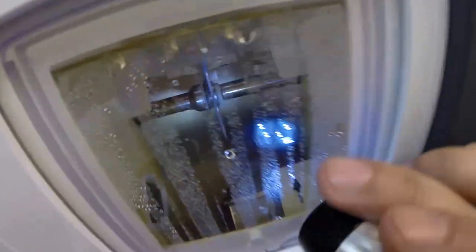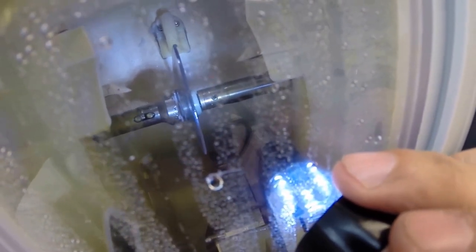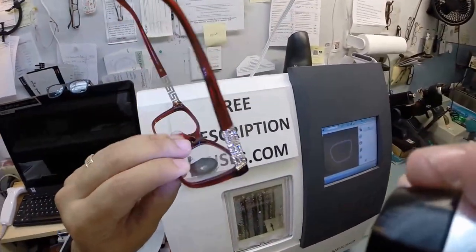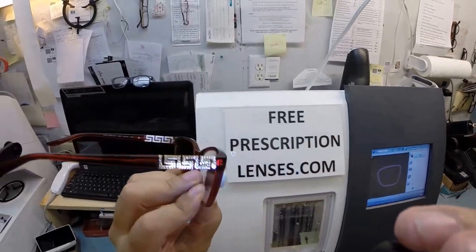And as always, measuring the thickness of the lens at every point to know exactly and precisely where to place the bevel, to give the best lens and cosmetic lens placement in the frame. And of course, with your prescription, you have no edge thickness whatsoever. So you're always going to have a great cosmetic value to this frame while you're wearing it.